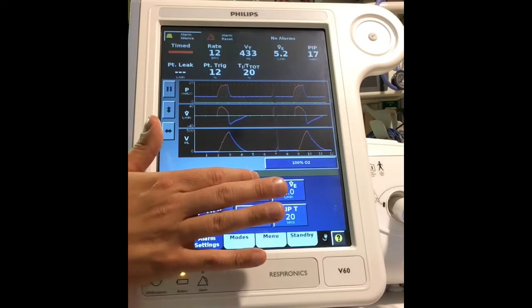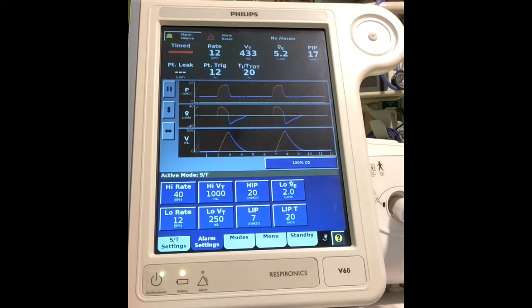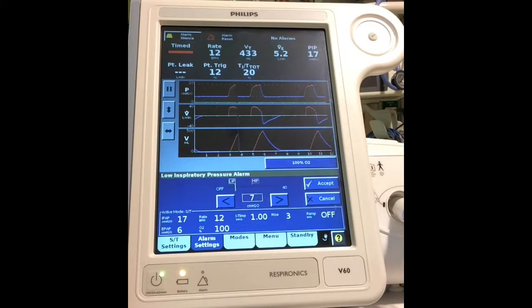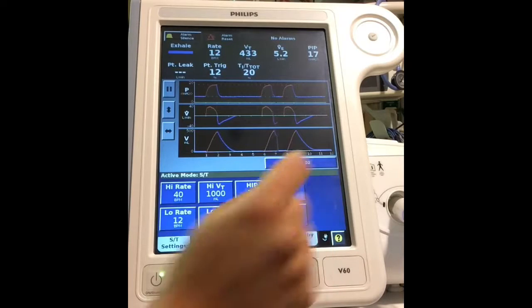Now, your HIP. Your HIP is your high inspiratory pressure. We keep that at 20, just in case our patient wants to take a nice big deep breath. That's okay, we won't get a high pressure alarm. Or if your patient starts talking, the machine may trigger if it's set lower. So this allows that patient to still talk while they're on the BiPAP and not have that alarm go off. Our low inspiratory pressure, we want to set that 2 below our IPAP. Down on the bottom, you can see what our active mode is, and you can see that our IPAP setting is 17, so we want to go 2 below that. 15 and hit accept.